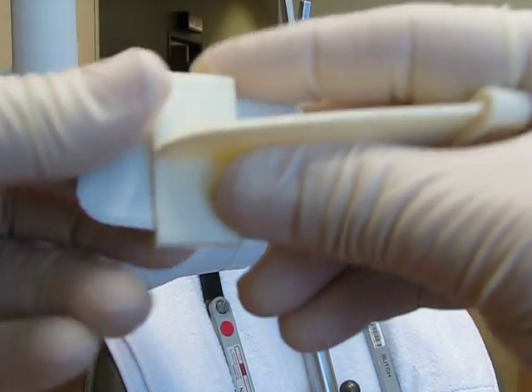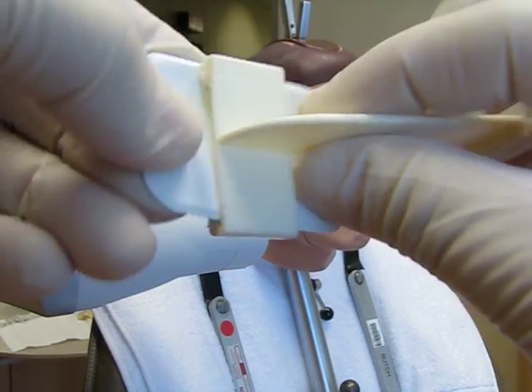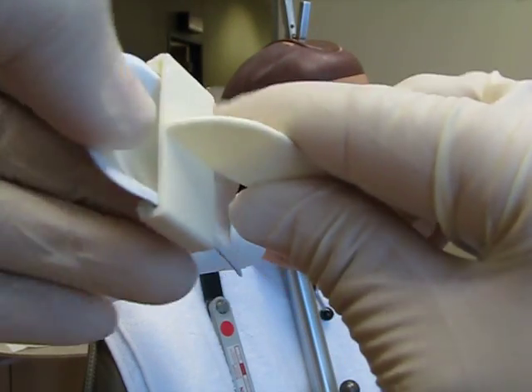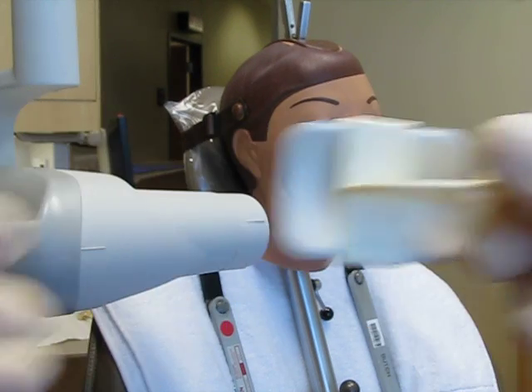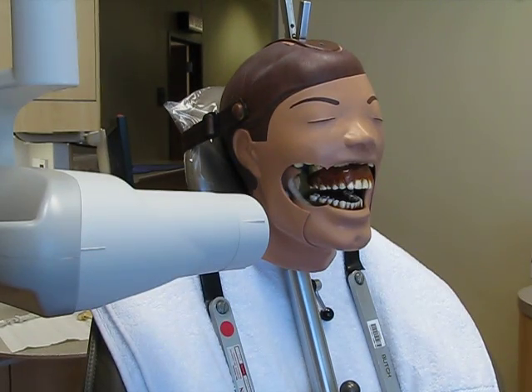Oh, we had technical difficulties. Okay. You put it in on one side first. You bend it gently. And you bring it up. Okay. Now if that would have fallen with a real patient, you would have gotten a new one.